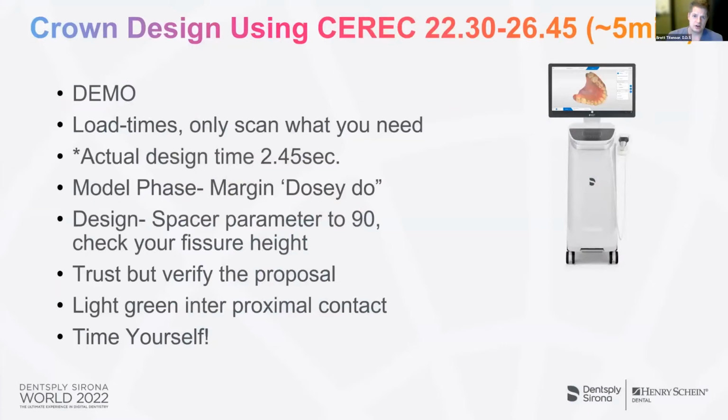All right, so crown design. Now in the 30-minute webinar series, this is one area I have to put on the chopping block, but a lot of times I like to demo some of these things. But one thing I've noticed is people take too long on the crown designs. If you're spending more than 5 minutes just sitting here with all the different tools on the Primescan and designing it, trying to make it look better, after 5 minutes, it just gets worse than that initial proposal.